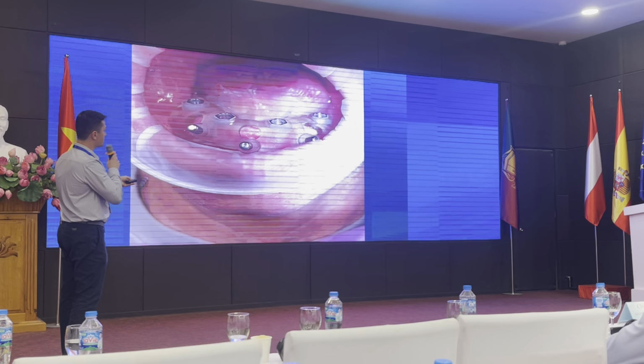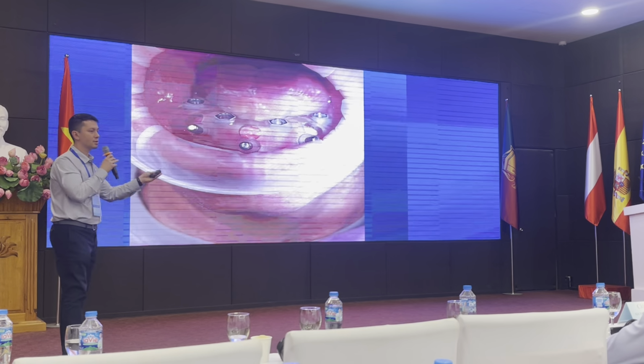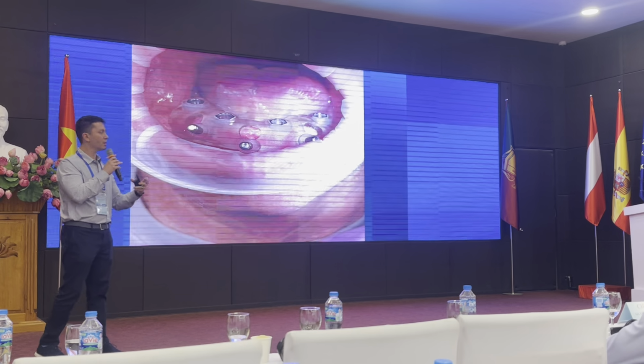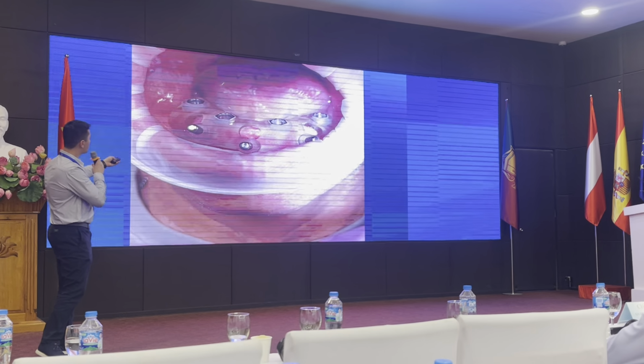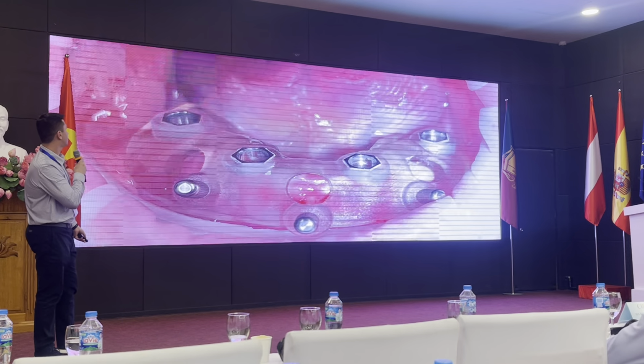Then I take this guide back off and I kind of scoop out where those tissue holes are, those circles are, and then I seat the guide back onto the mandible. And then I go through and we do our drilling sequence.